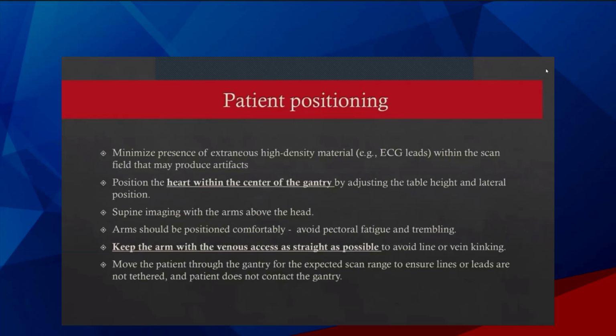You want to make sure the patient's supine with the arms above the head and they're in a comfortable position, so they're not straining or trying to hold their arms up. If you need to, place pillows, or sometimes you may need to use another positioning device to help the patient hold still. So we want them to be comfortable. We don't want them to strain, basically. So the more relaxed the patient is, the better your scan is going to come out.